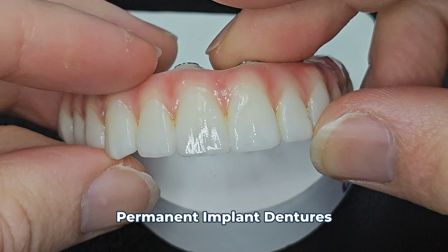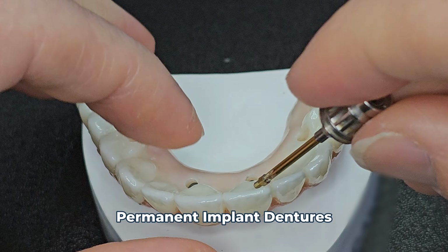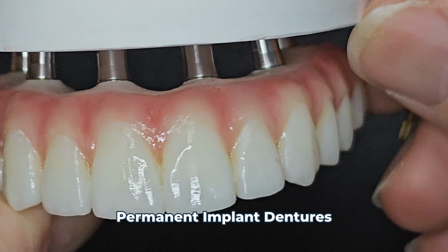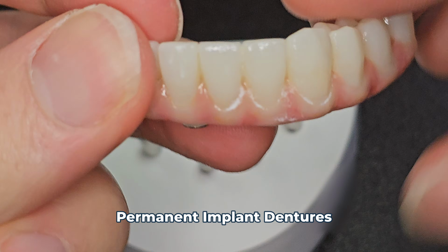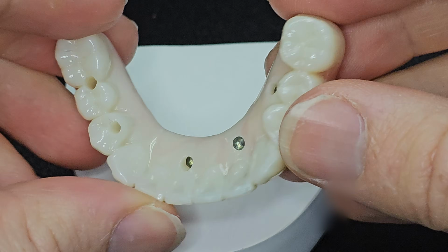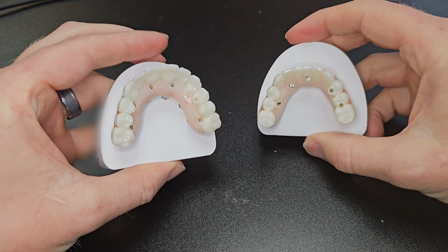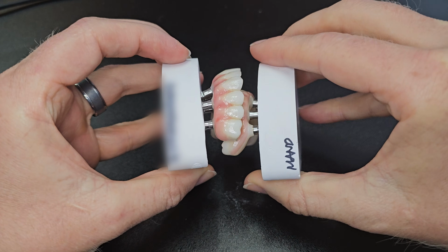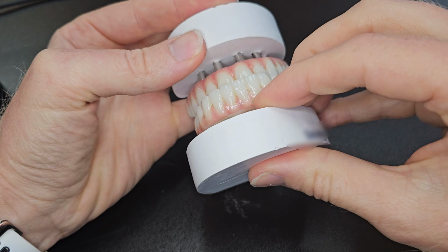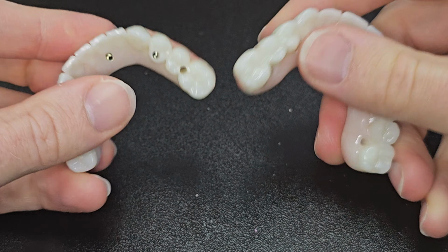In between this and the last appointment, we have the final implant dentures back from the lab. We chose to make the implant hybrid denture with a metal bar and zirconia on top of it. When you feel them, and if you were to feel this, everything is as solid as a rock and slightly heavier than they look. Again, I test everything out on the stone analogs and it lines up perfectly. So I know the final appointment is going to look and feel great without any hiccups. In fact, I am at ease because I know they're going to look similar to the provisionals that I've already made, and everything is in the exact spot.